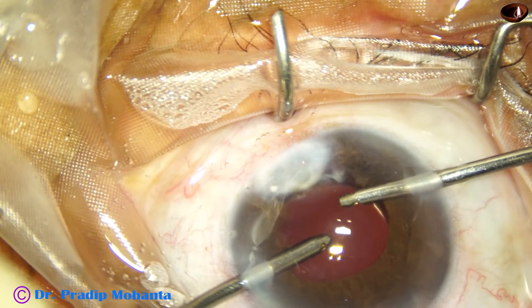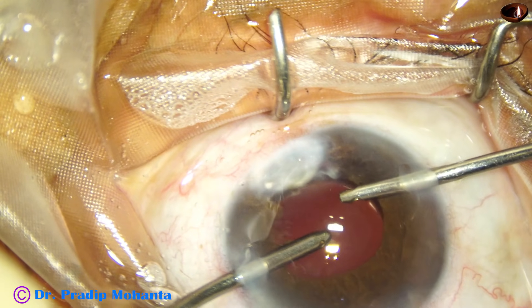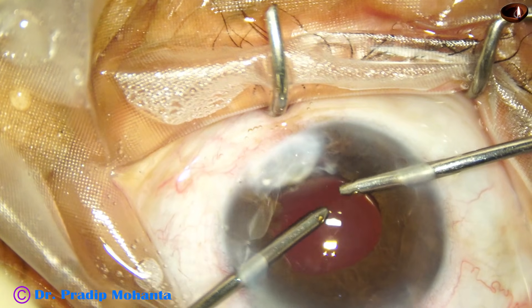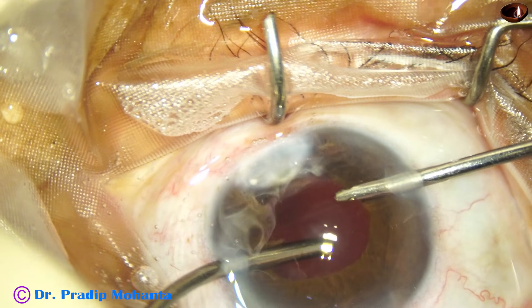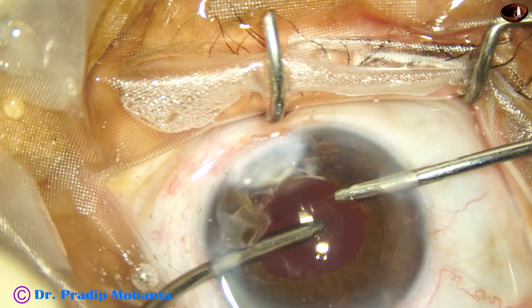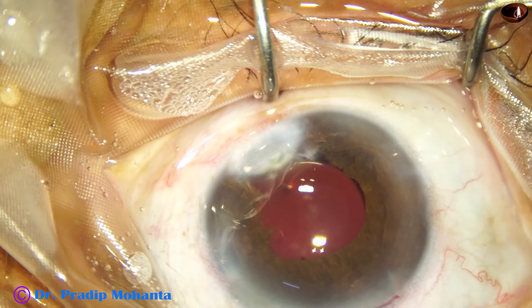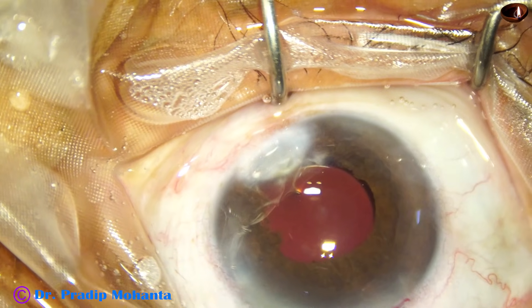Glistening — I have not seen in these lenses. I have no financial interest, but we are very happy with these lenses. IHANS is an enhanced monofocal lens from Johnson & Johnson and that is doing very well. Patients are happy with IHANS.